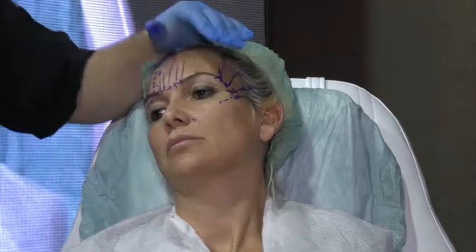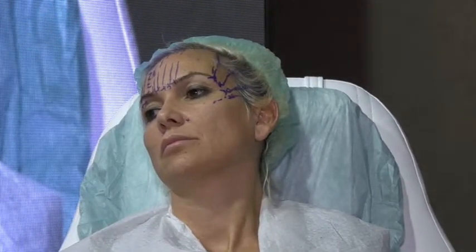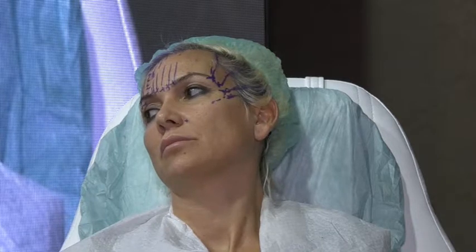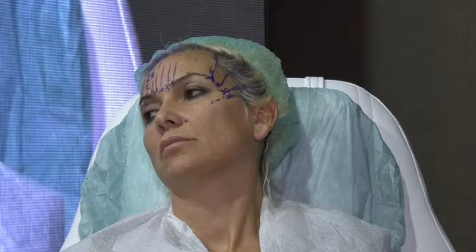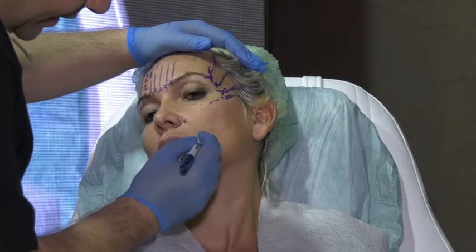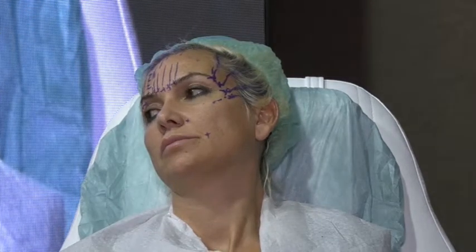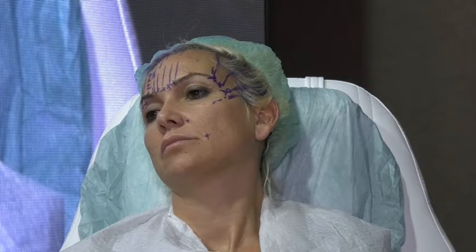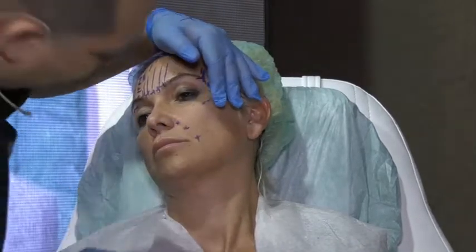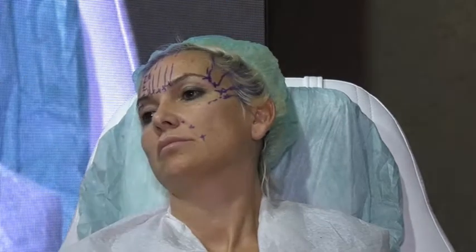Then, my first point. I told you, we work zone by zone. Where is the end of the mid-face zone? At which level? Angle of the mouth. So my last point should be either exactly at the angle of the mouth or 1 or 2 millimeters above. Also, it has to be 0.5 centimeter lateral to the nasolabial. And if I want to add a third one, where is it? Exactly in the middle in between. So that's my third one. Fantastic. So where should I go now?